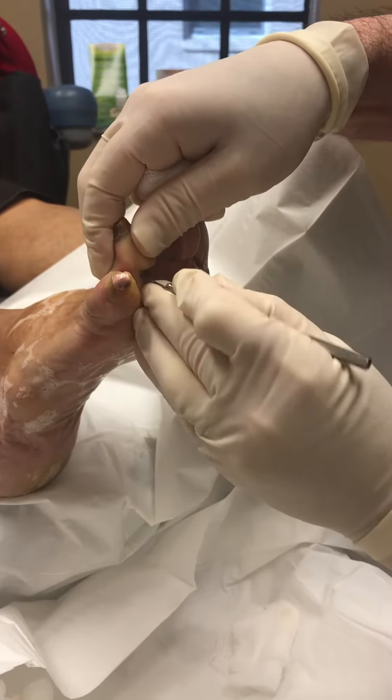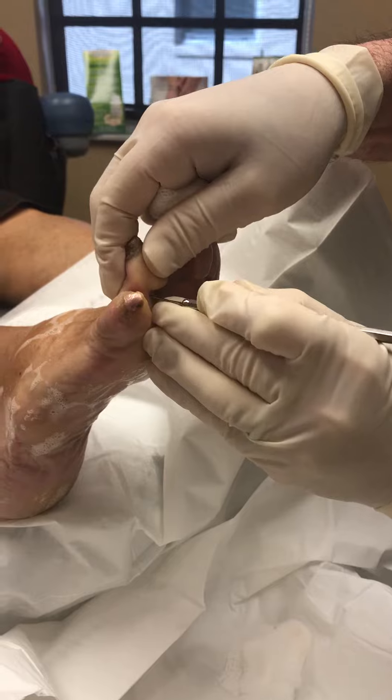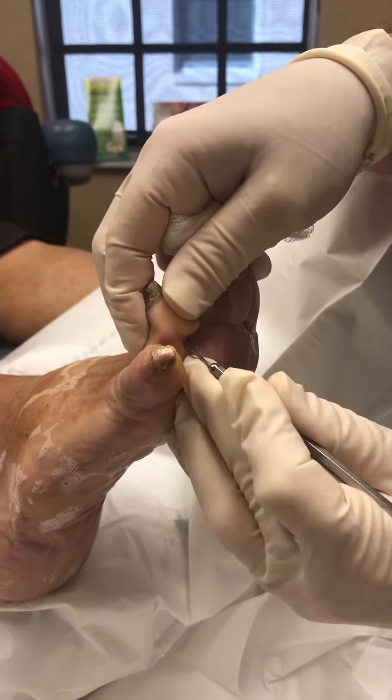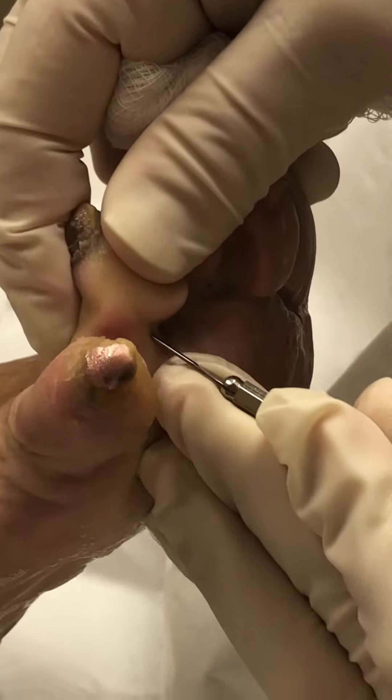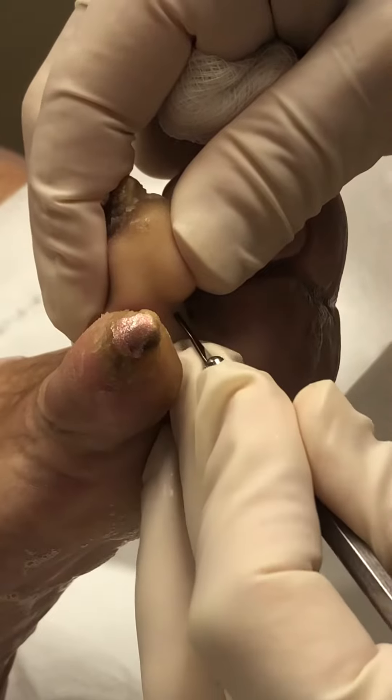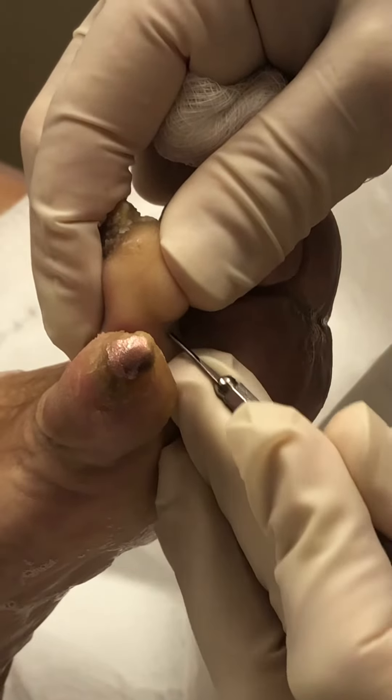If we're close enough, you can actually hear the tendon being cut. We also have to release the capsule as well.